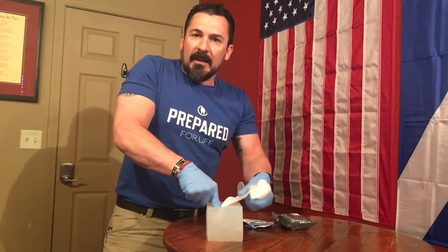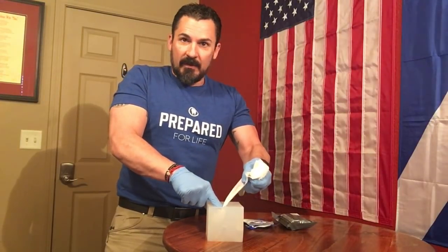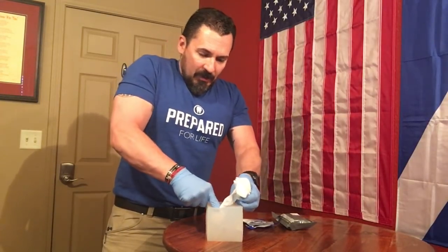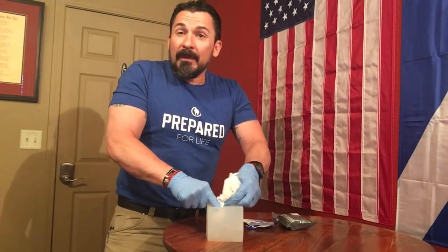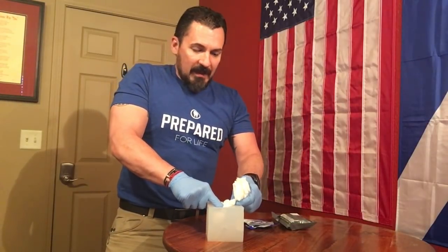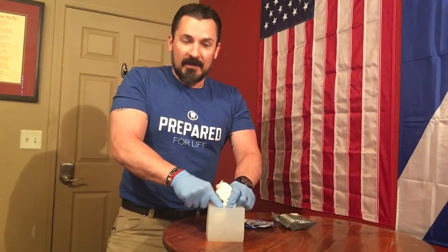And think of it like this. When I say sewing machine method, this is my needle, this is the thread, and this is my bobbin. This is the cassette that holds that thread. So I'm just going to be relinquishing pressure just long enough to get that dressing applied into the wound. And I'm going to keep making sure I have good, solid, consistent, direct pressure on this until I get this wound completely packed, because that's going to be your key. Good, solid, consistent, direct pressure.